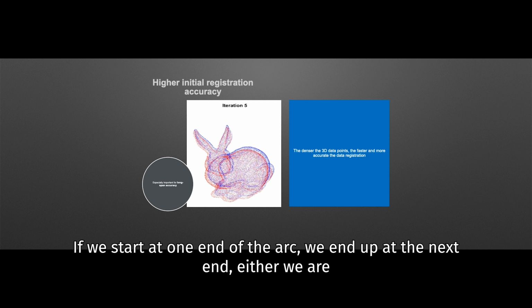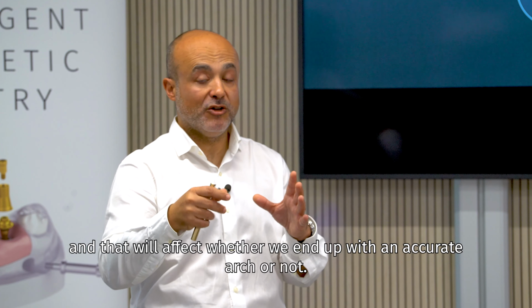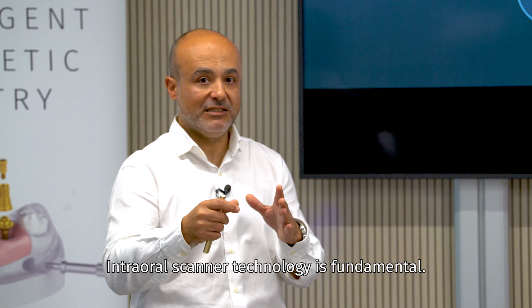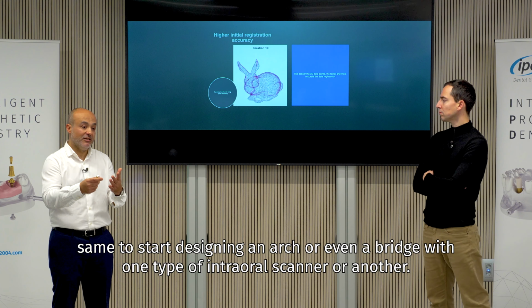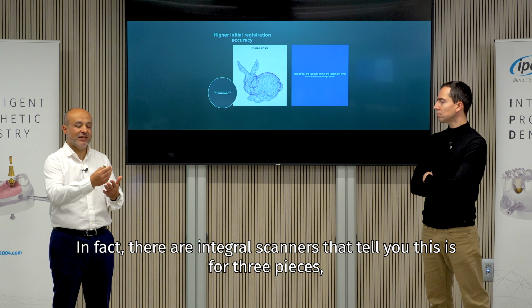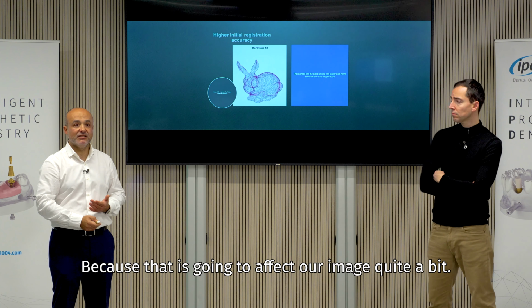If we start at one end of the arch, we end up at the other end. Either we are correlating points correctly, or we are correlating points incorrectly. And that will affect whether we end up with an accurate arch or not. Intraoral scanner technology is fundamental. That is why we want to explain the difference, so that we know that it is not the same to start designing an arch, or even a bridge, with one type of intraoral scanner or another. In fact, there are scanners that tell you this is for 3 pieces, this is for half arches, this is for full arches, and they have different levels, because that is going to affect our image quite a bit.